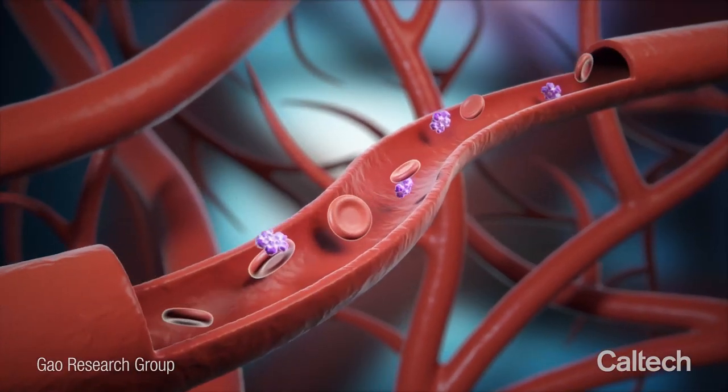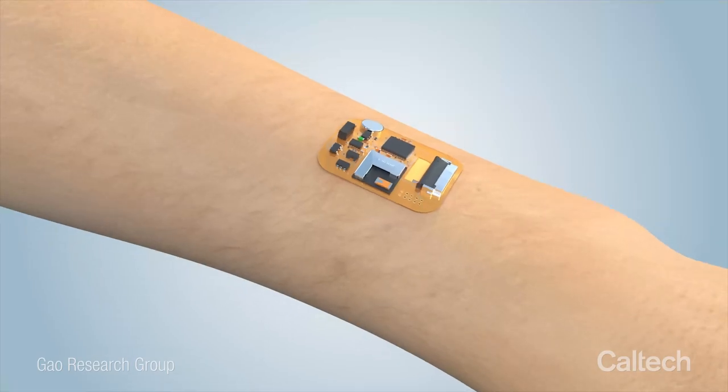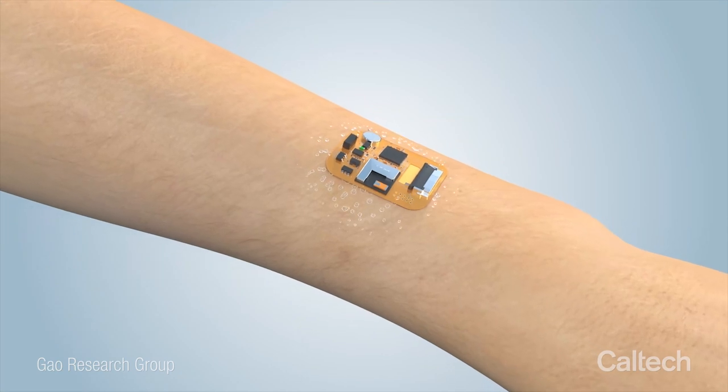CRP exists in low concentration in the blood and its large molecular size means even lower amounts pass into sweat, making it very difficult to detect.